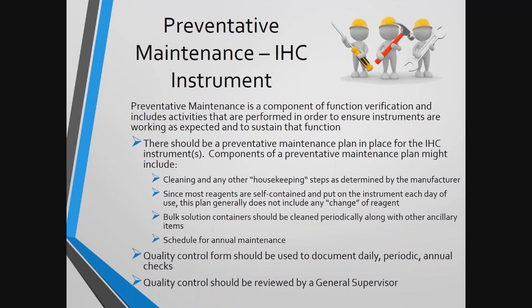This activity is usually performed less frequently, like annually or biannually, than our more housekeeping activities, which are likely performed daily or weekly. The manufacturer generally has recommendations in their operations manual of what actions need to be taken and at what intervals in order to properly maintain the equipment.